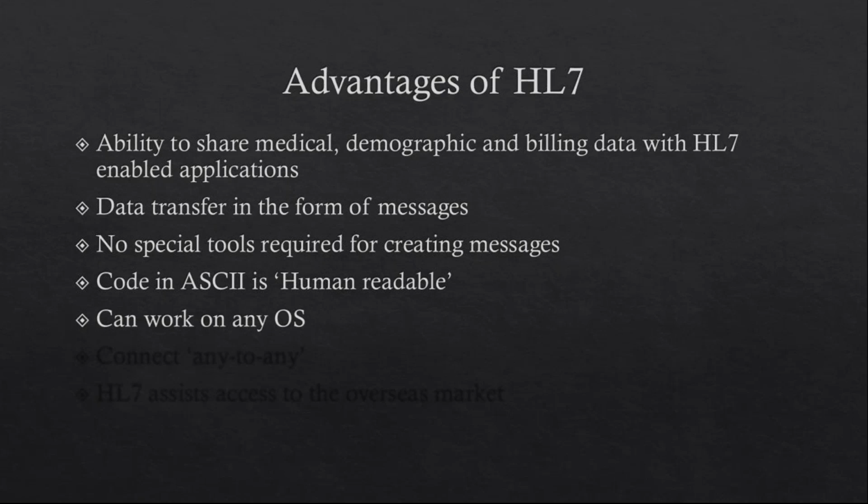It can work on any OS. It doesn't matter. It can work on Linux, it can work on Unix, because it mainly operates on an application layer. Each OS has its own application layer. Linux has its own, Windows has its own, Apple has its own. So as it operates at the application level, it is completely independent of OS, and an HL7 message can be generated or interpreted. And it can connect from any application to any application.